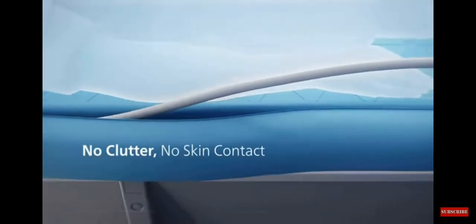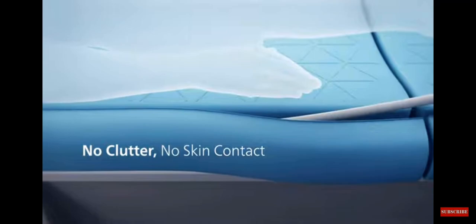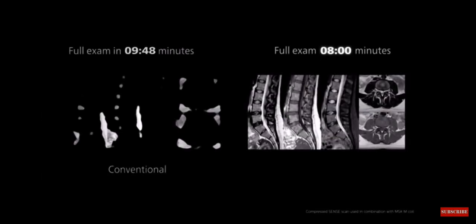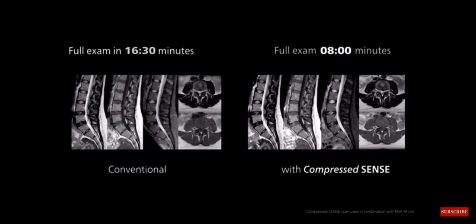While the MR5300's innovative Comfort Plus mattress simplifies cable handling, Compressed Sense speeds MR scans by up to 50% with virtually equal image quality.